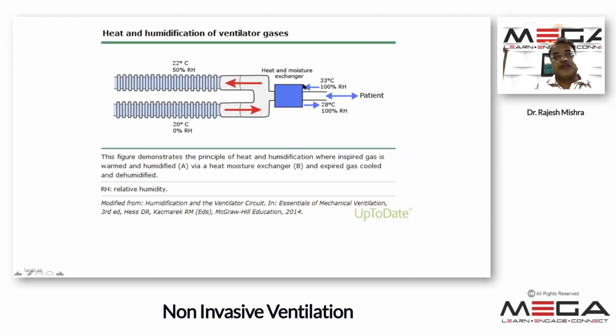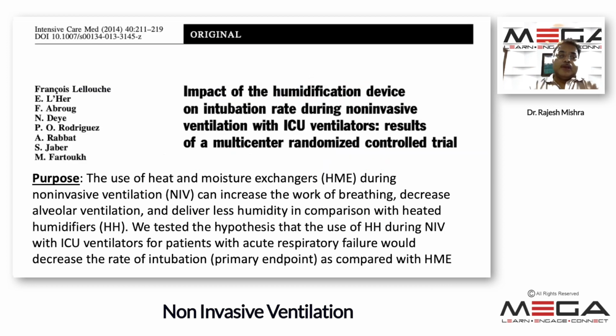Passive humidification works by the heat and moisture exchange principle, and it achieves appropriate humidification. What was the concern with HME? That by using an HME, it may sometimes get blocked, or it is dead space, and you may not be able to ventilate properly.